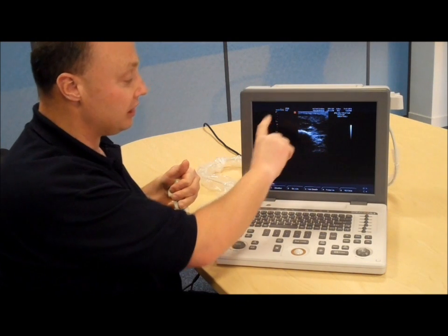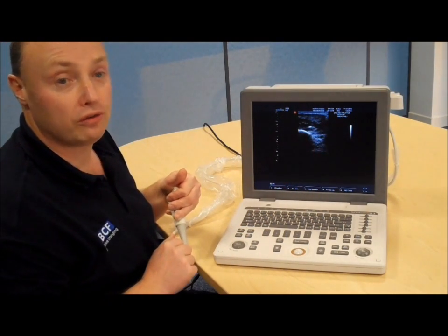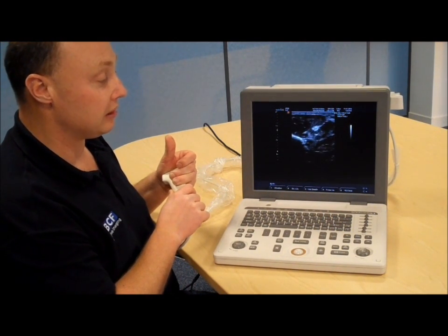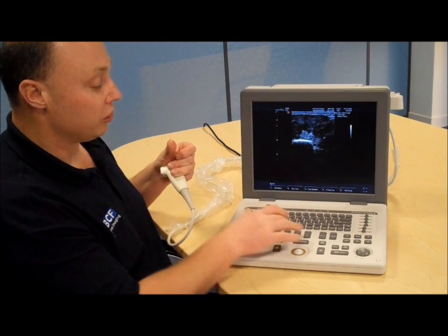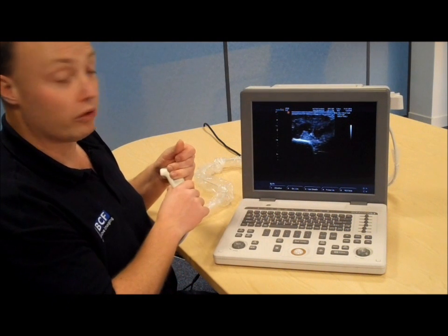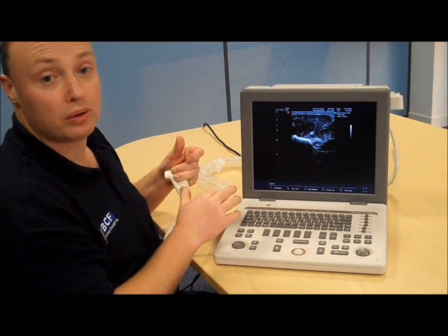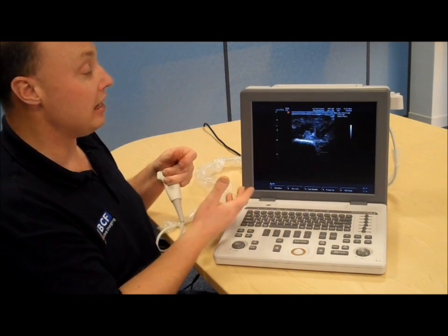The scanner is set to 5 centimeters of depth, so we're looking at 5 centimeters of depth on the screen, and we're showing a resolution frequency as well. You can now start to scan your suspensory. As you scan, you can change your depth, making the image bigger or smaller as you see fit. You can change where you're focusing — you can see the focus points down the side. Button number 4 increases or decreases the number of focus points. You can also change the frequency — penetration is 5 megahertz, general is 8 megahertz — it just cycles through. Your frequency button gives you the capability to change the nature of the image.